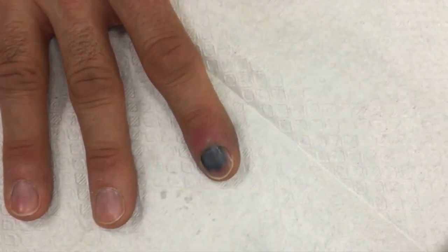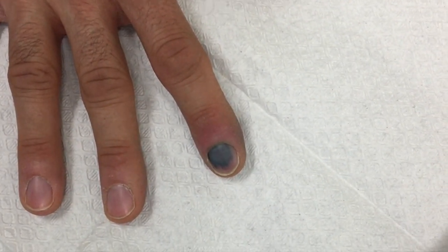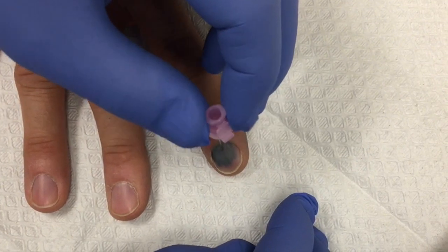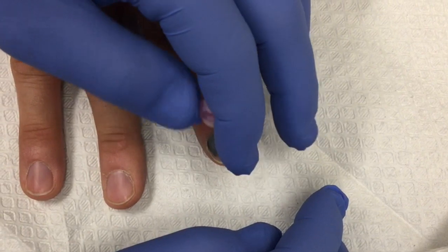We're gonna drain what they call a subungual hematoma, and we are going to drain this with a little needle. It shouldn't really cause much pain here at all, so it's just slow — let me know if it hurts you, okay?